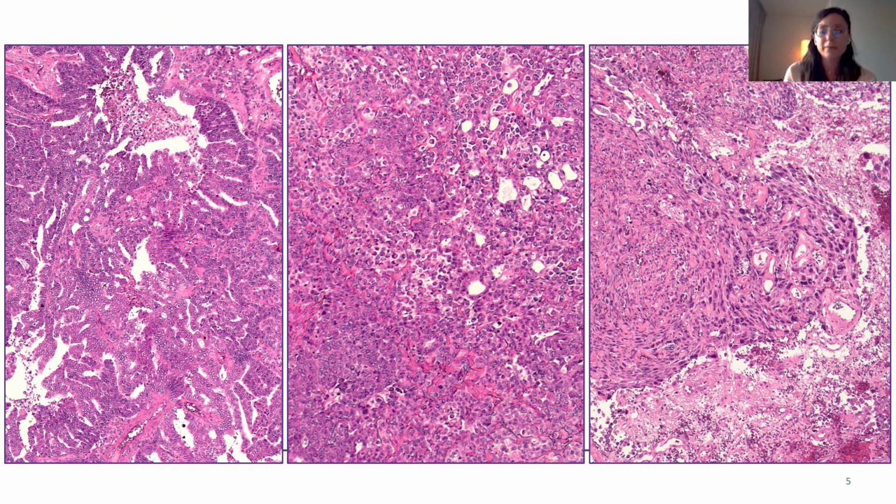So the reason why I'm stressing that is because based on the analysis and on a chat between the oncologist and pathologist, it was actually acknowledged that a kind of origin from an adenocarcinoma could be described. On the left-hand side, you have a field of this tumor that is clearly forming some kind of glandular features.